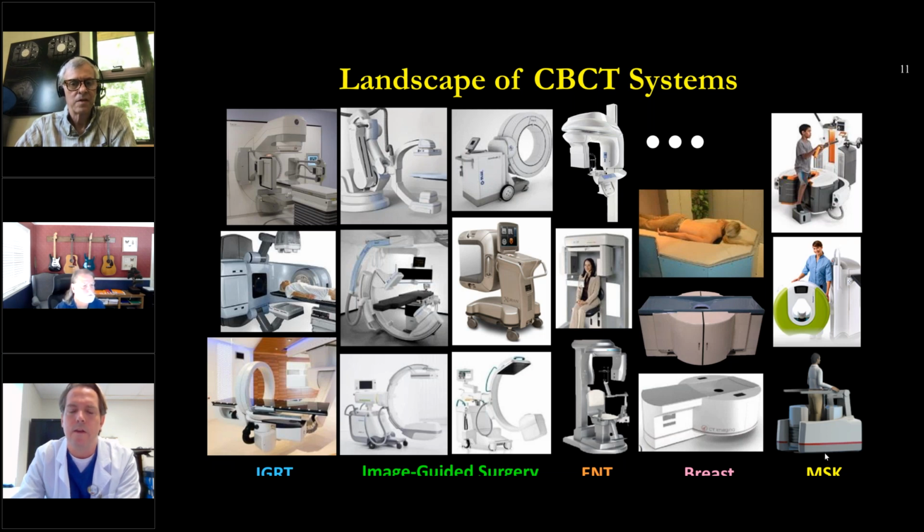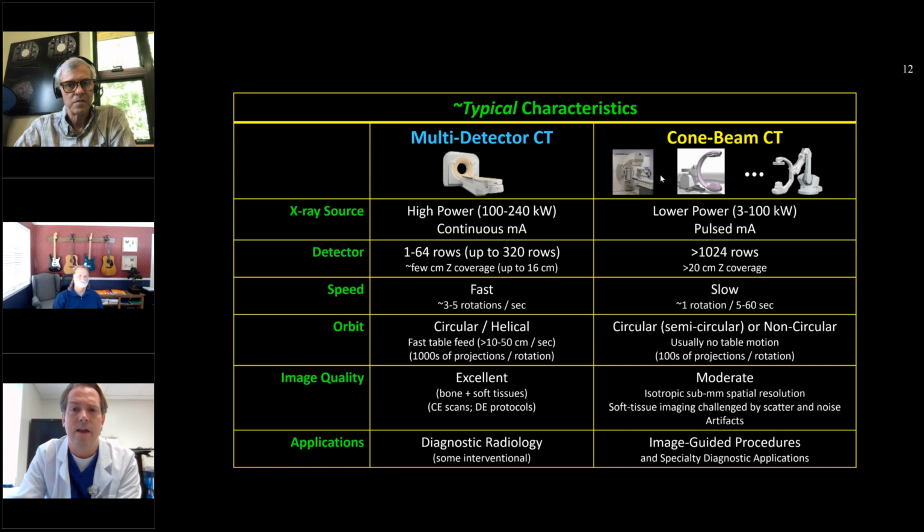And so as John described and Elliot remarked as well, the need to evaluate and have more reliable and quantitative physics testing standards for this technology is imminent because many of the old standards break. And in applying those newer, more quantitative metrics, we find that they're actually applicable to whole body MDCT as well. You'll see that. The difference between these two technologies, I'll try to go relatively quickly.